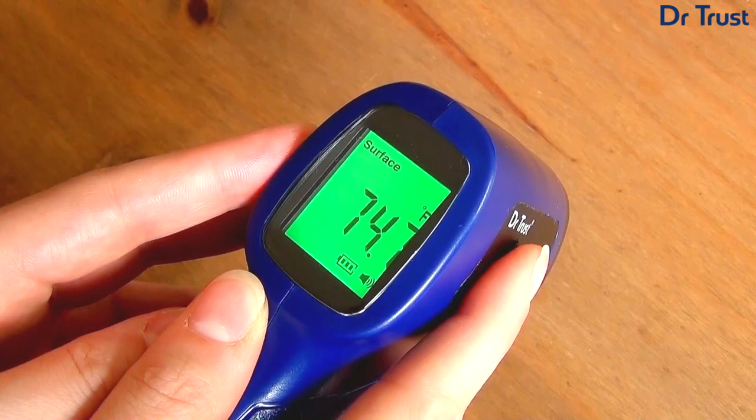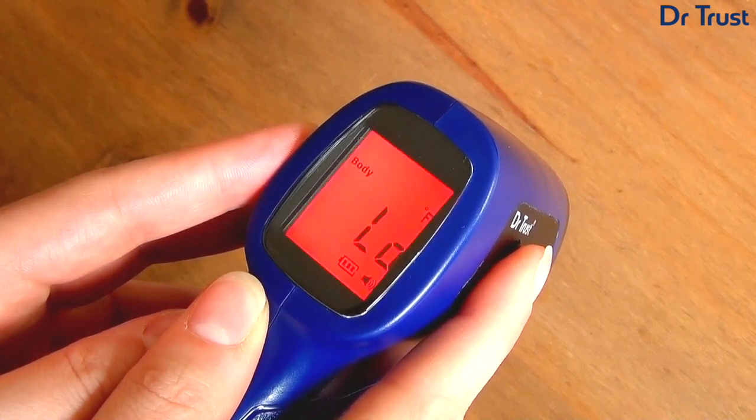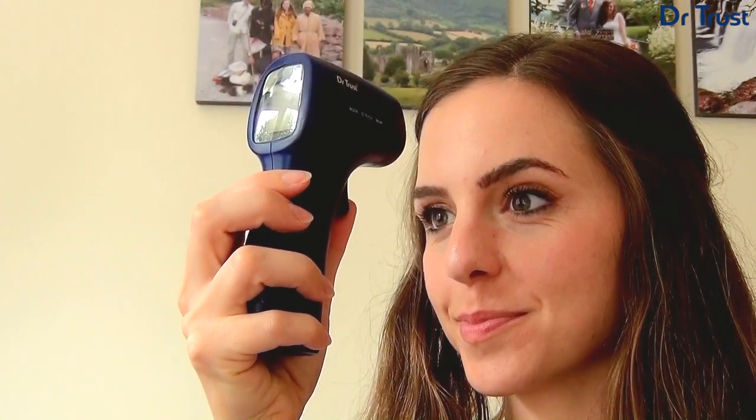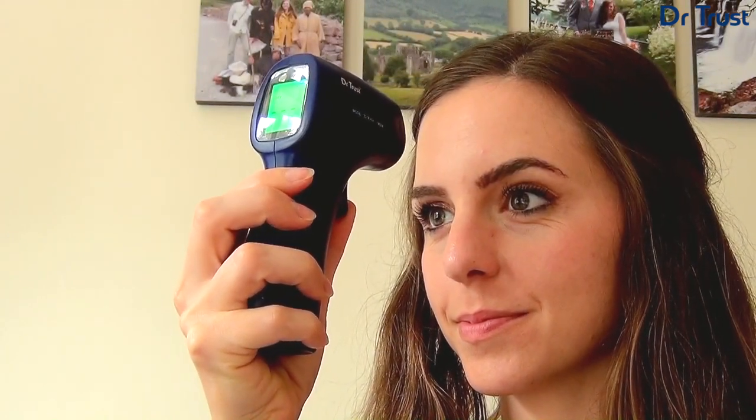To take a forehead measurement, press the mode button to access the body settings and then hold the device 3–5cm from the centre of the forehead. Press the measure button to take a reading.